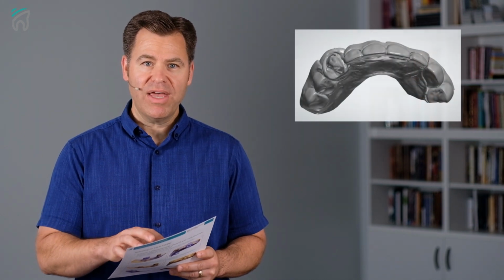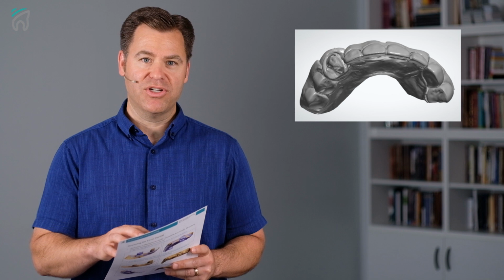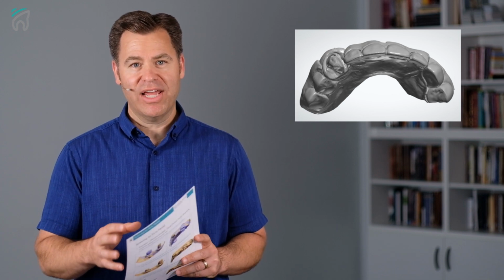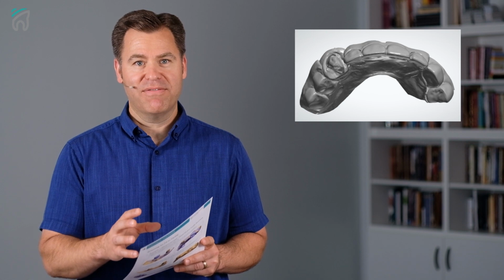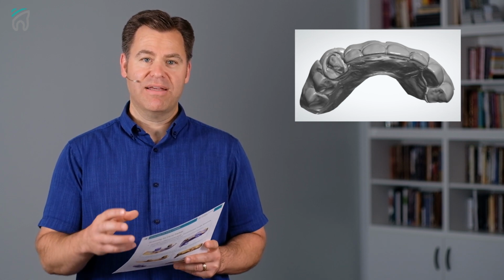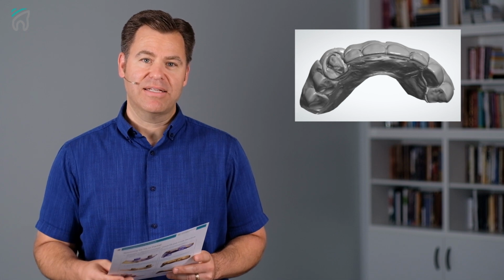The second scenario for fit to partial is when you have a poorly fitting partial, or the tooth itself doesn't fit the partial well. In that case, leave the partial in place when you're scanning your preparation. This is challenging, but you try to capture all the different internal angles and aspects of that partial around the preparation. Then we'll do our best to fit that crown into that space.